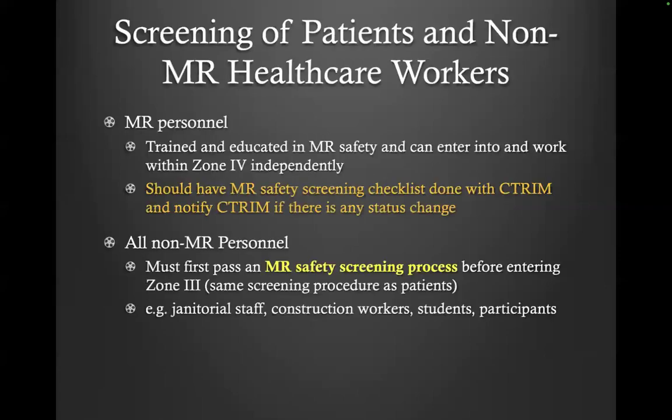Okay, MR safety guidance. MR personnel, like you guys, should be trained and educated in MR safety, and you can enter and work within Zone 4 independently. But you should have the MR safety screening checklist done with us, and you should notify us if there is any status change, so that you can do your own MR screening checklist. If you have any questions, you should let us know.